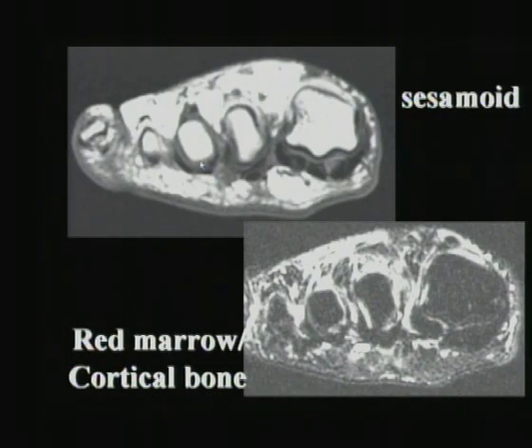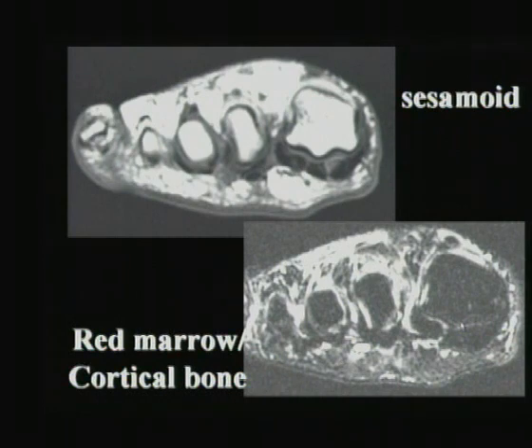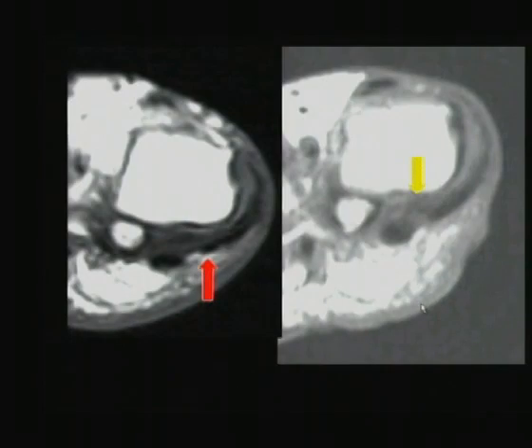Here is a more florid example. On T1-weighted imaging, we see no normal marrow signal in either sesamoid, and on T2-weighted imaging, we continue to see no normal marrow. In my opinion, that is hypertrophy from chronic stress. I don't know if it's truly normal, but I am quite convinced that it is asymptomatic.